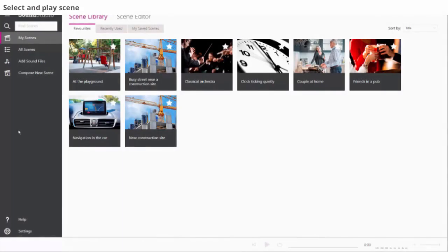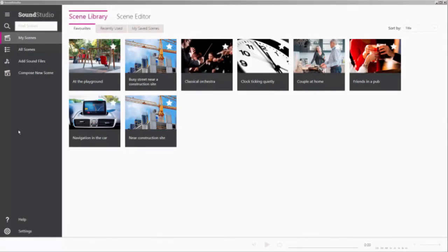Upon launching SoundStudio, you can access the My Scenes library. It includes a selection of sound scenes commonly used as examples in counseling and fitting. Simply click on the scene you want to play.